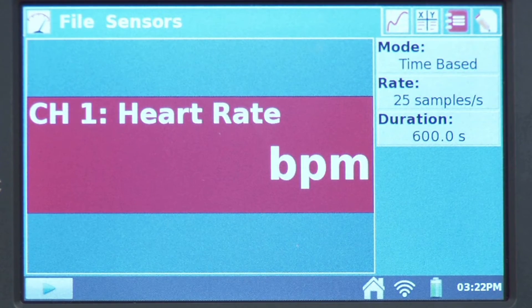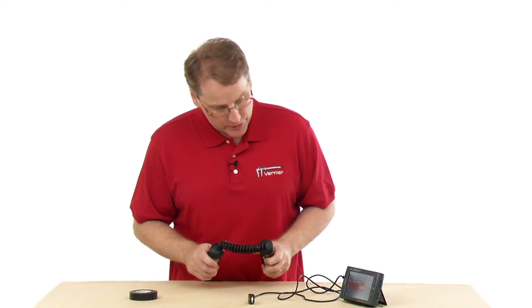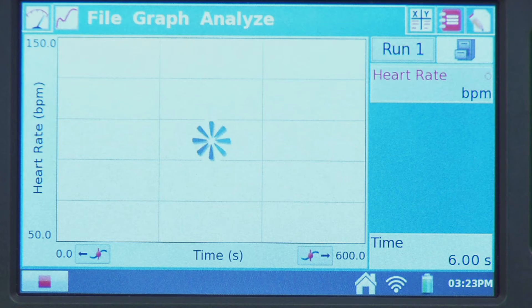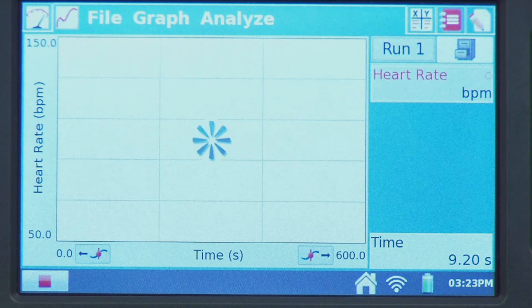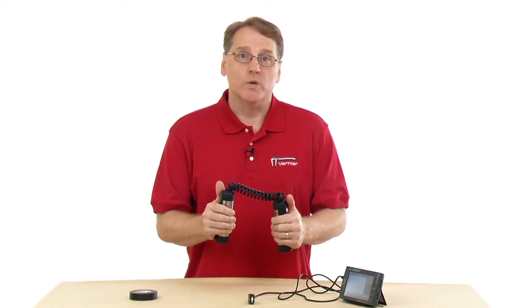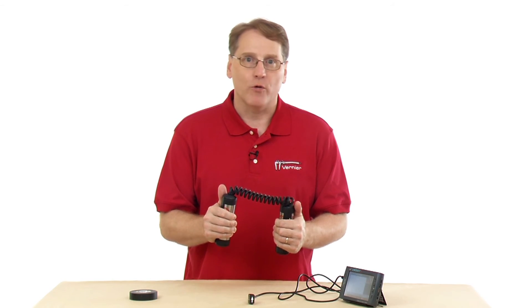Let's look at the default collection parameters. It's time-based and collects at 25 samples per second to capture the heart rate. It defaults to ten minutes, assuming you'll be doing some exercise. Once ready, press the collect button and hold the hand grip in your hands. There will be a lag between when you start collection and when the heart rate displays on screen, because it needs to collect a number of beats over a unit of time before displaying a value.